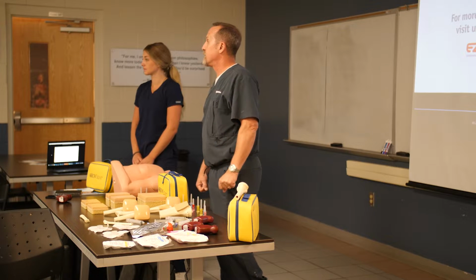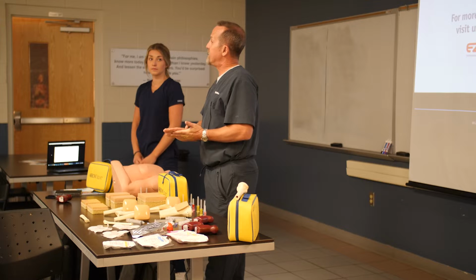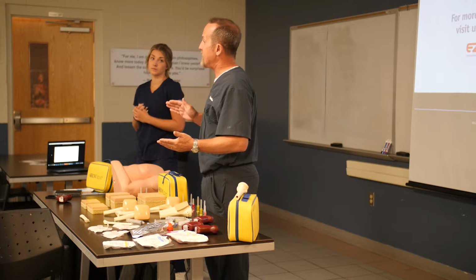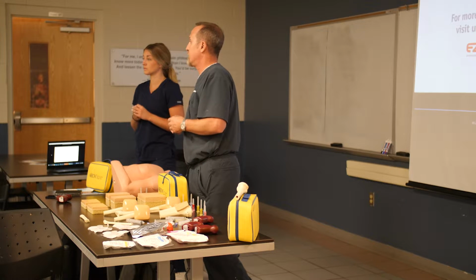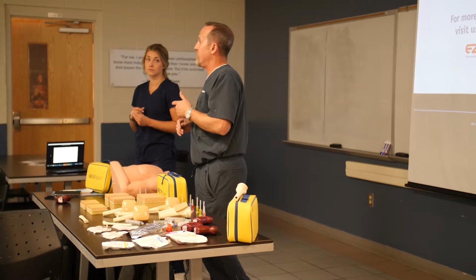Same question on the distal femur. With the distal femur, what we said is patients from 0 up to about 15 is where you start getting into that age range where the tissues are fully developed, and it's very difficult to get through the cortex there. So if you can palpate your landmark, that's good. If you can feel your landmark, you can go for it, okay?